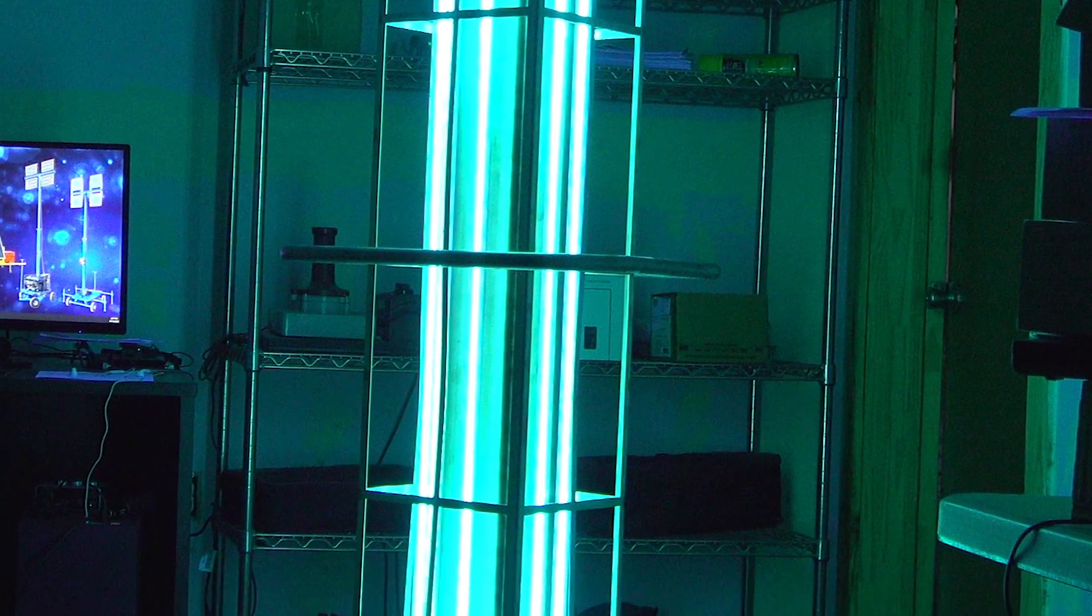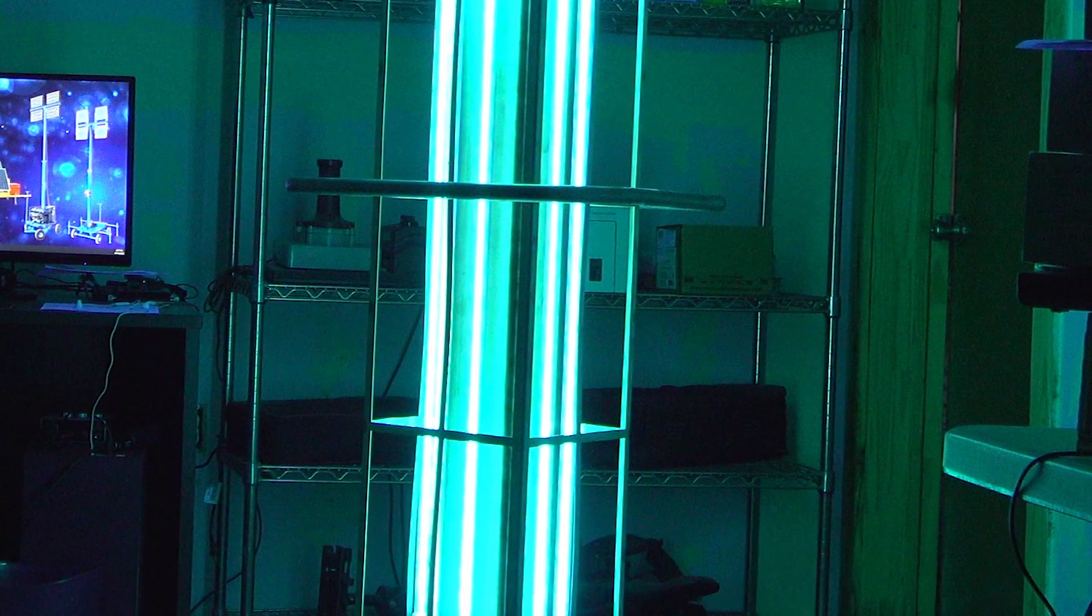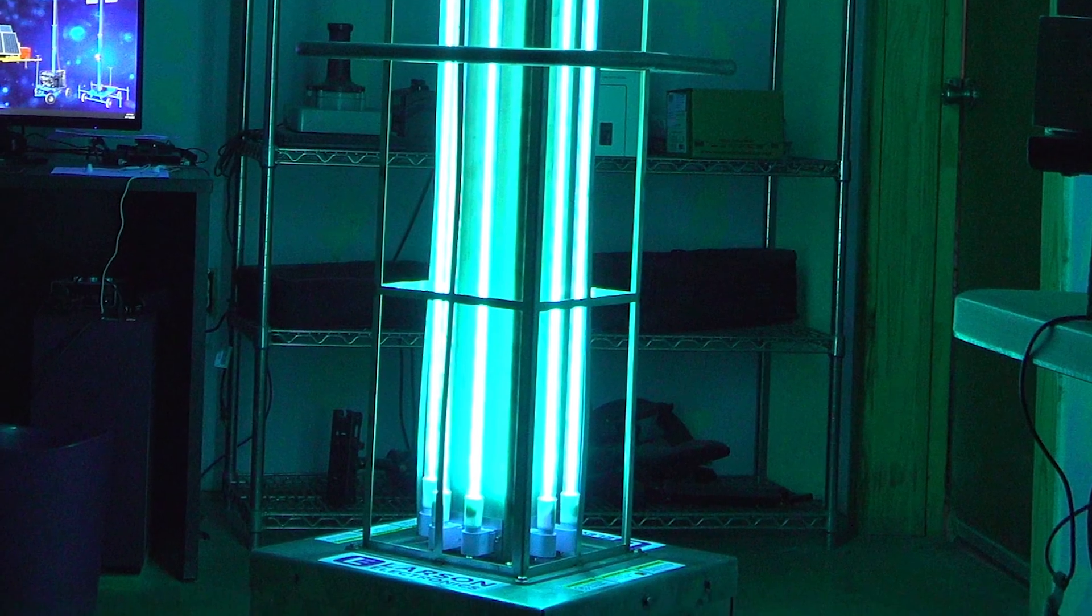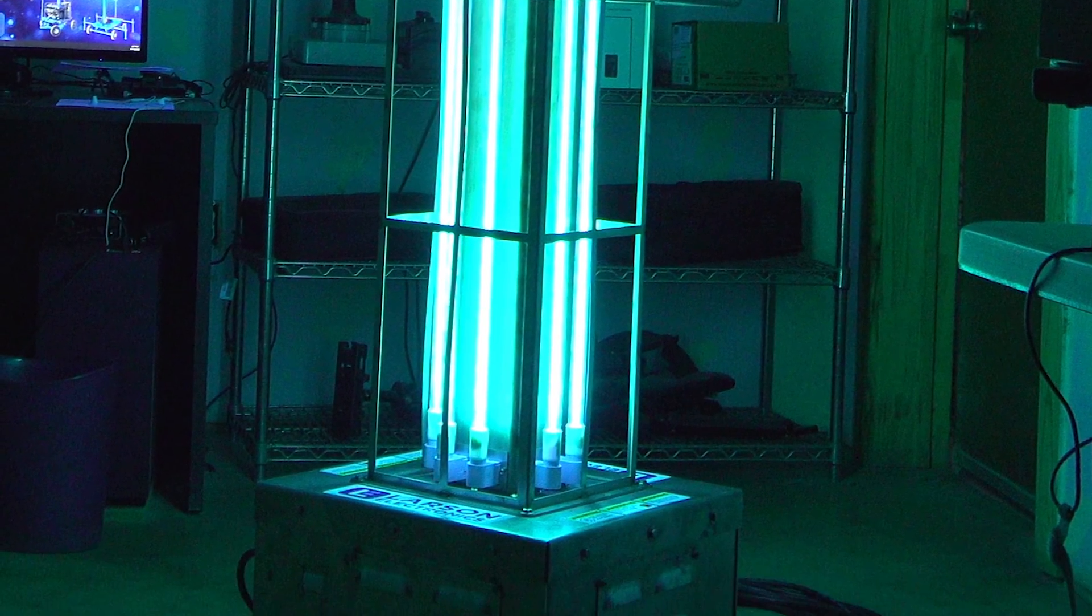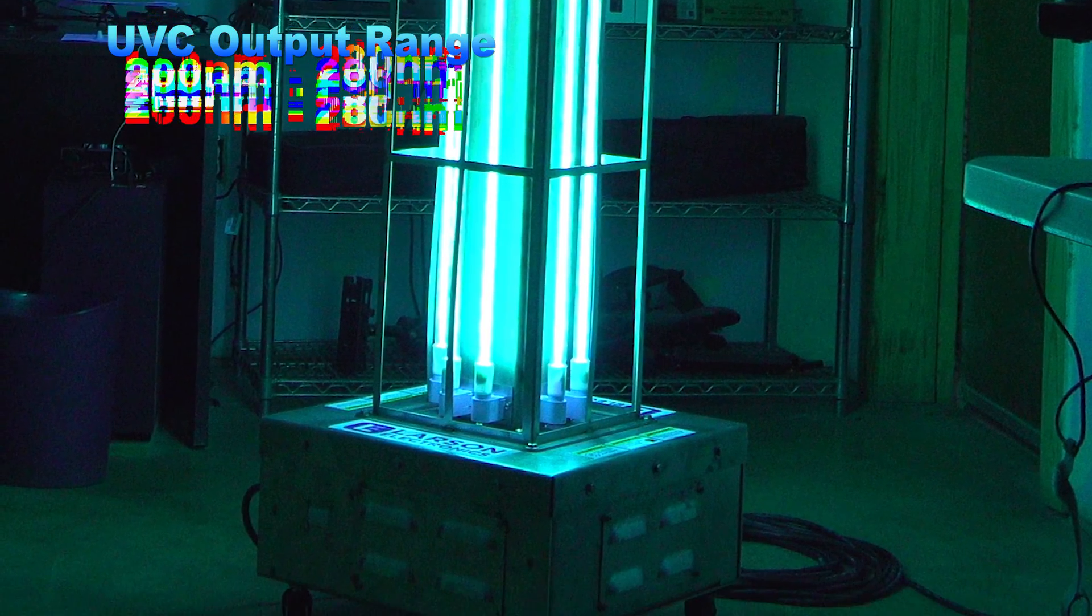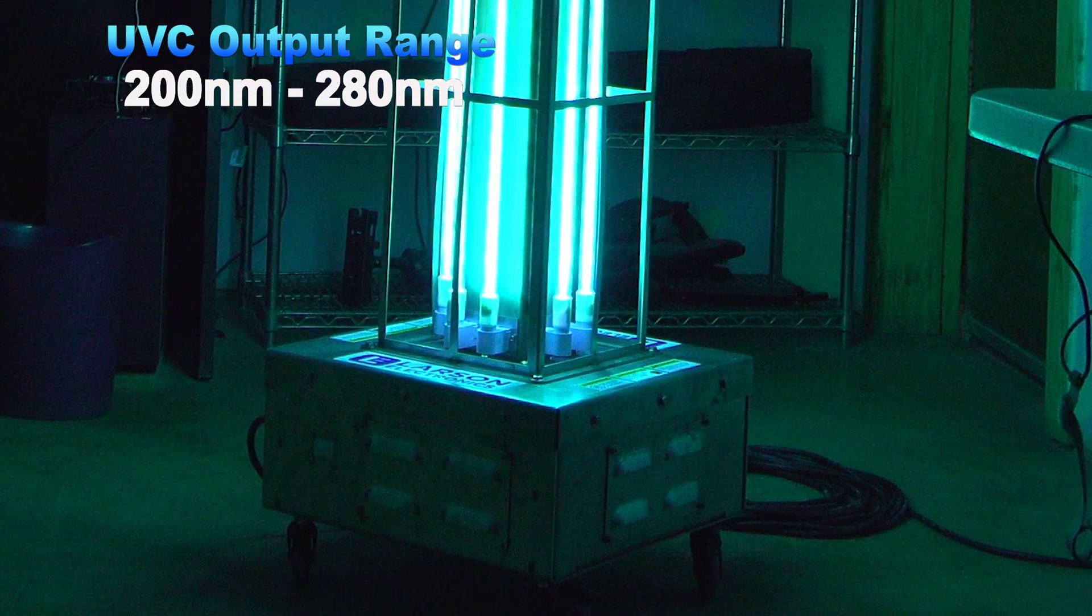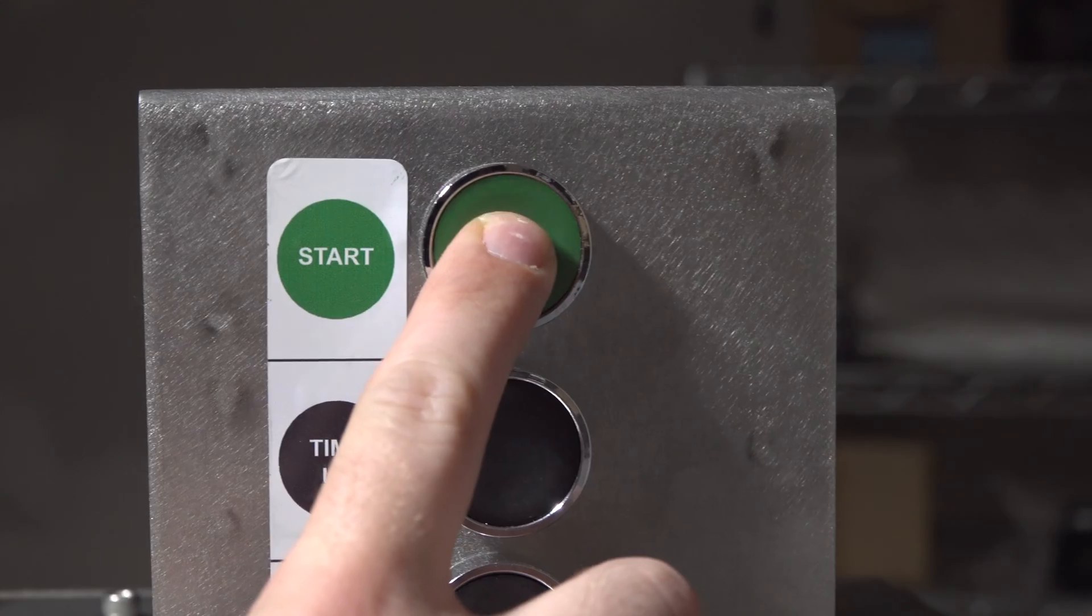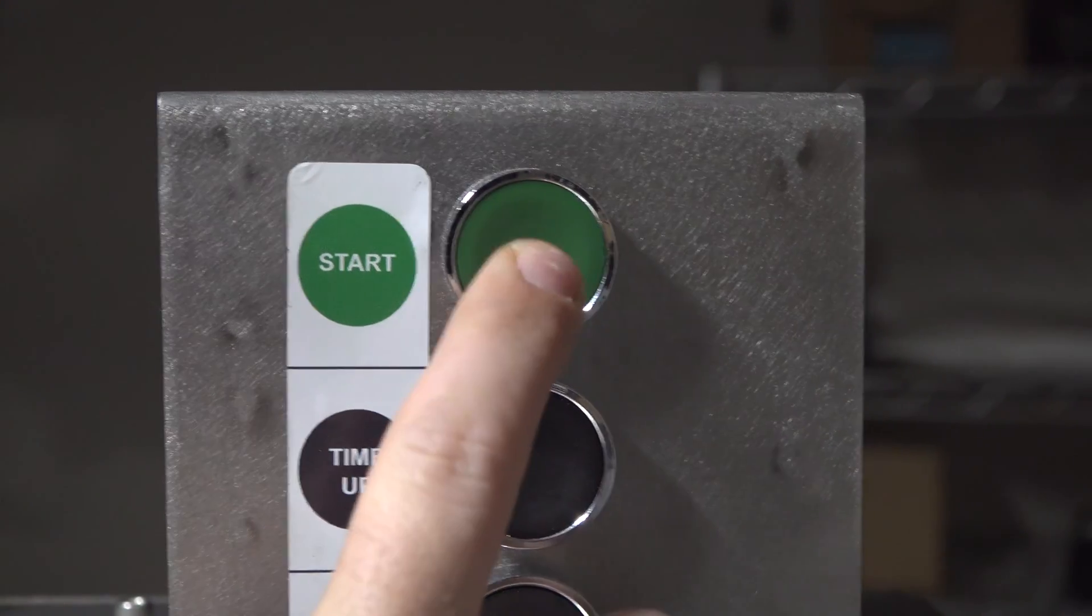These industrial grade UV carts kill up to 99% of viruses using an output range of 200 nanometers to 280 nanometers of germicidal UV light.